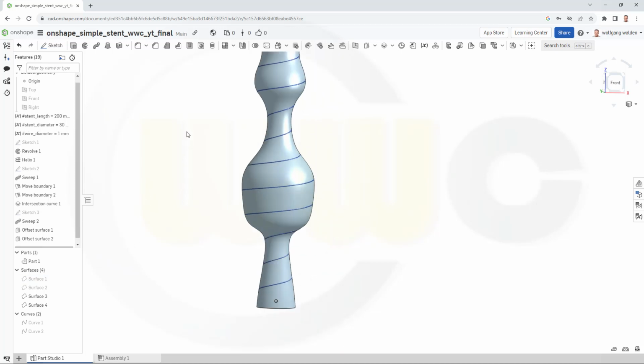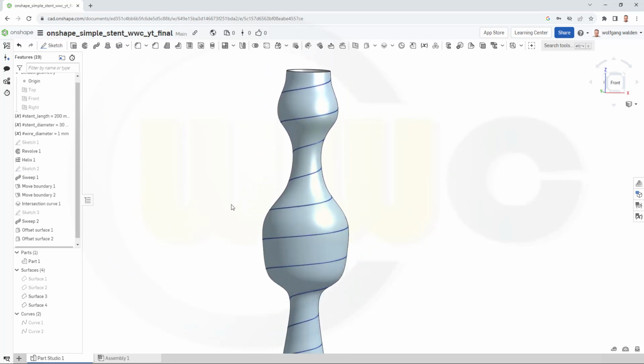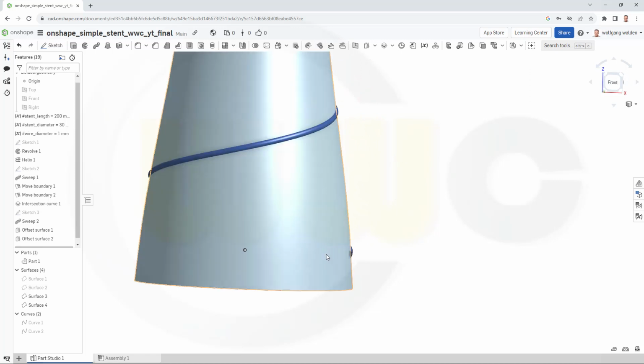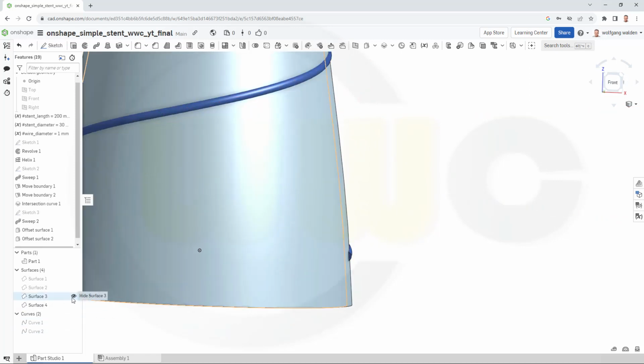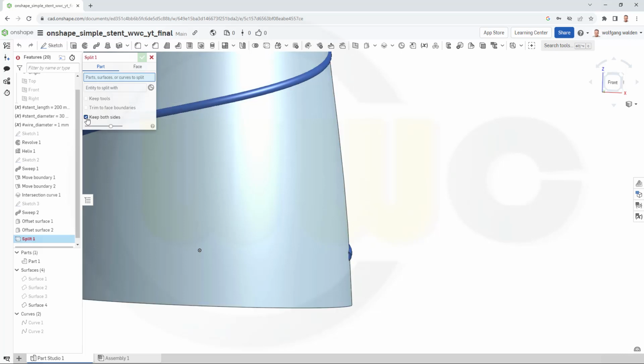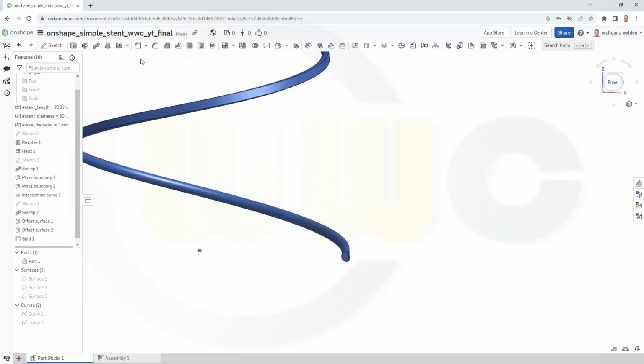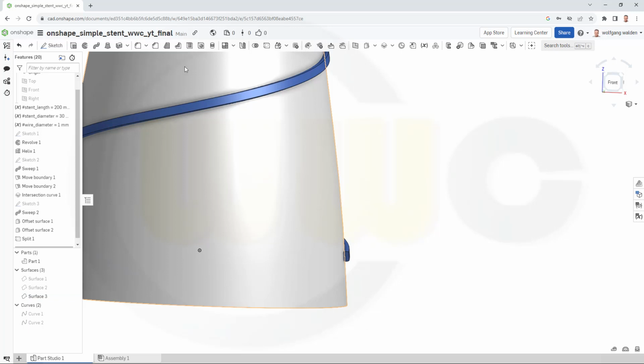And now I want to split that part here. And I will take a look where that is good to see. Yeah, here we go. Maybe hide first the inner one, if it's really the inner one. This should be the outer one, and I want to remove that part here. So, go for a split. I don't want to keep both sides. The part I want to split is that part here. The splitting tool would be surface 4. And it seems to be okay. I don't want to keep the tools, so just confirm, which removes this side. Now let's use surface 3, make it visible, and do the same again, split.